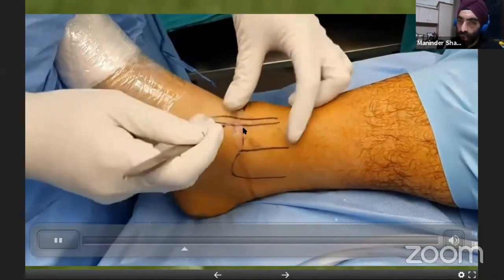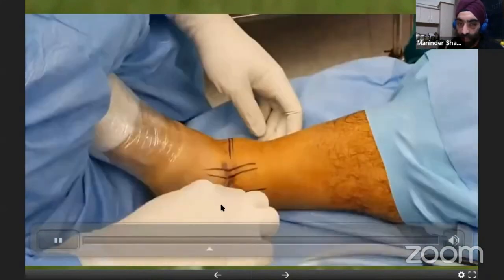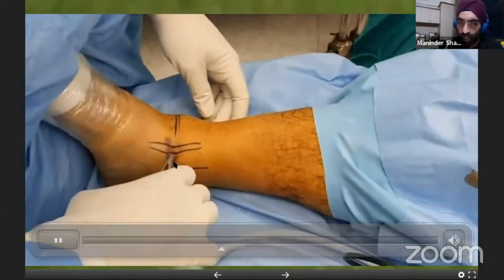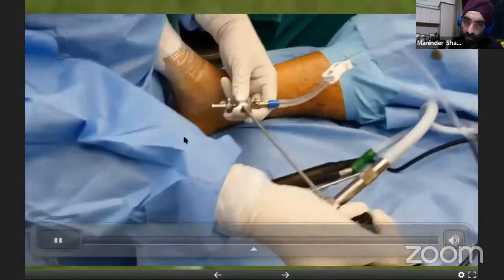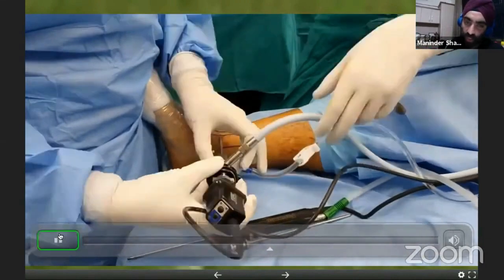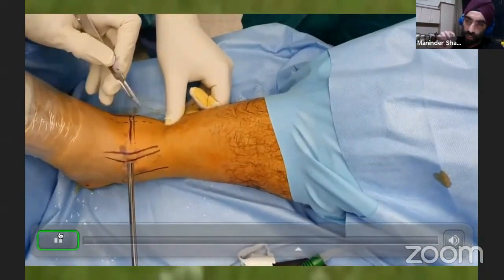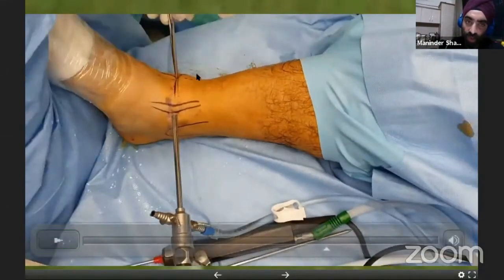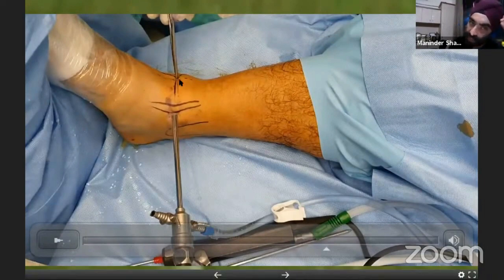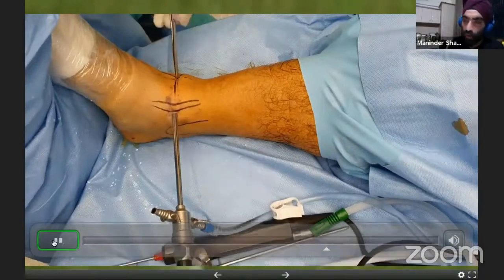The medial portal is just next to the tibialis anterior tendon. At that area you have the saphenous vein midway between the tibialis anterior and the medial malleolus, so stay close to the tibialis anterior tendon but don't injure its sheath as that can cause tendonitis. Keep the scope pointing horizontally, as parallel to the joint as possible. For the lateral incision, mark the superficial peroneal nerve — you can sometimes identify it by flexing the toes.